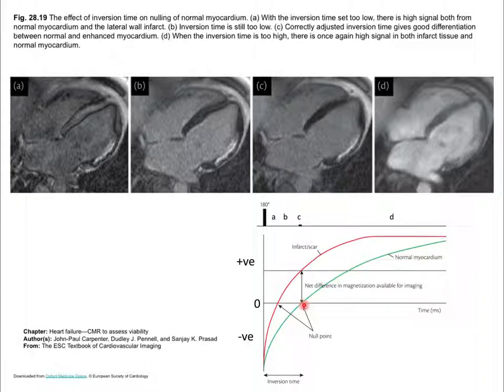And the reason that's done is that traditionally when you make a magnetic resonance image, you just look at the magnitude of the magnetization. You don't look at its phase. And it just made a lot of corrections easier if you ignored the phase, because many things can change the phase. Motion, magnetic field offsets, a whole bunch of things. And so when you try and make a phase-sensitive image, you get all these phase shifts across the field of view that you don't see on a magnetization magnitude image. That's what all of these are, magnitude images.